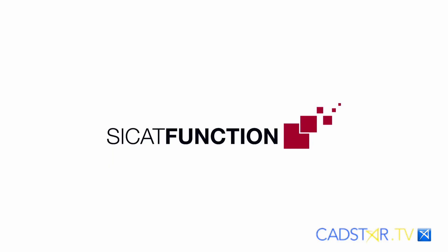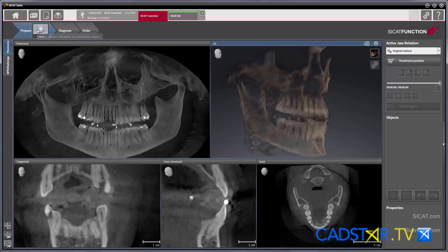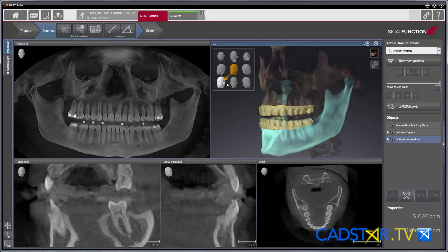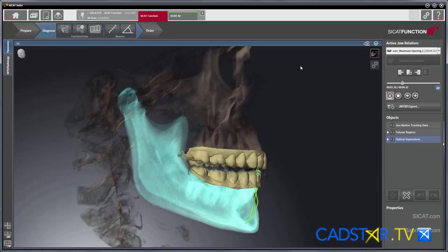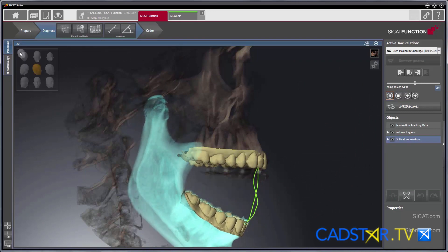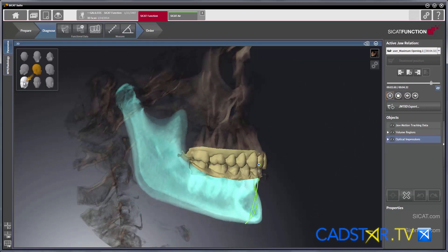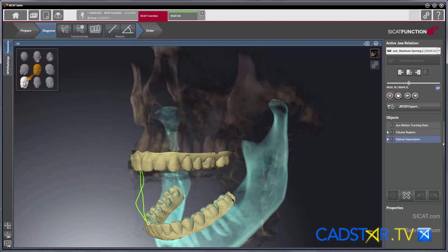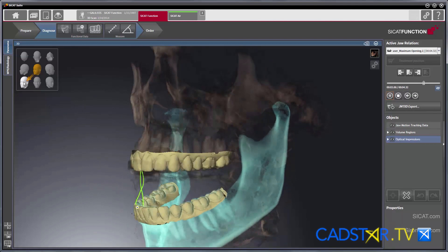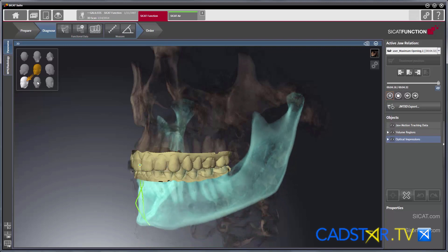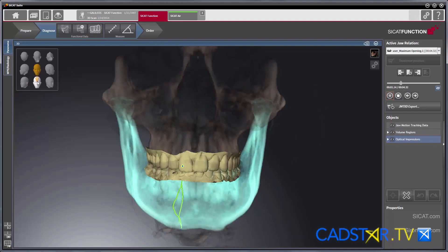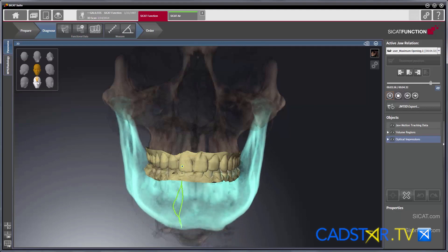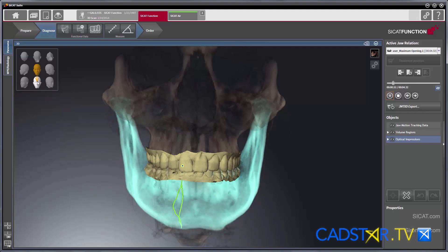SICAT Function and jaw tracking allows us to look at the joint, allows us to find the full functional envelope of a patient — even those terms we used to use back in dental school, like immediate side shift and Bennett angle. We can now do jaw tracking and import the functional analysis of that patient into the CEREC.